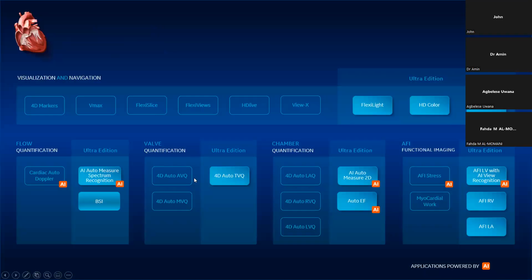We can get lots of information about the aortic valve sizing of the LVOT, annulus and the bulb, mitral valve about the annulus, the areas of the leaflets and the diameters, and the tenting height, tricuspid valve likewise for the annulus and the tenting height as well. We'll show you that in a second.